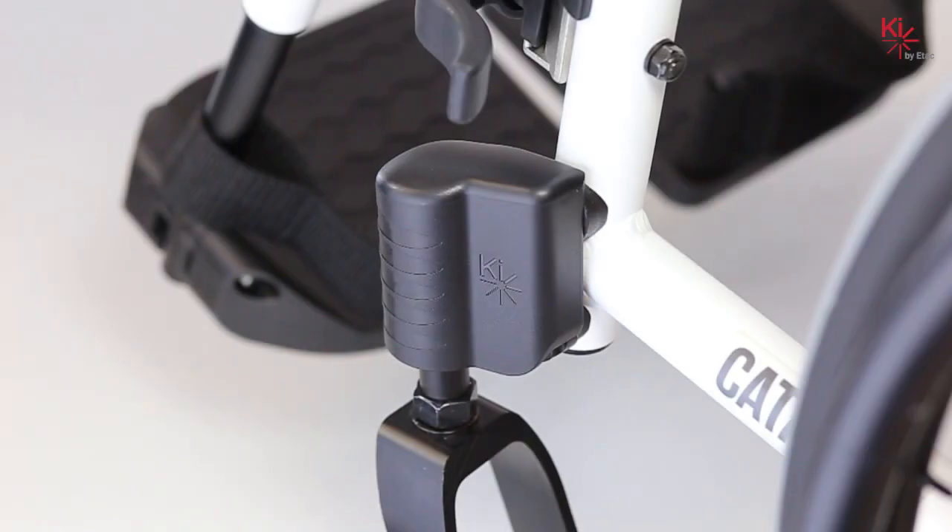In this video we will explain how to re-square your casters when your catalyst is outfitted with a performance caster housing. The tools required to make this adjustment are a five millimeter allen key.